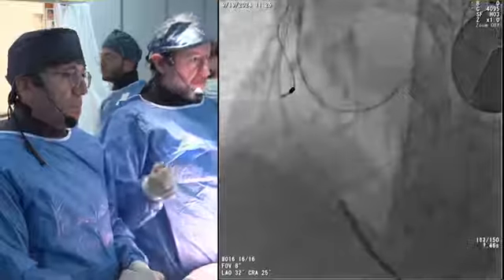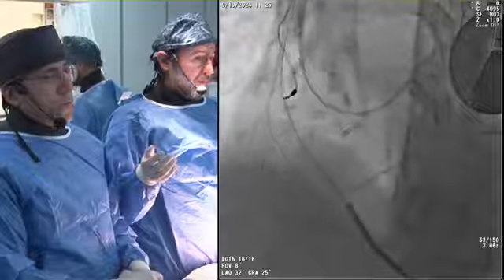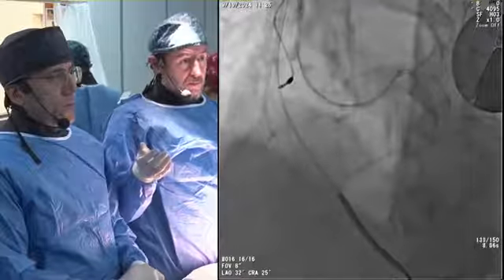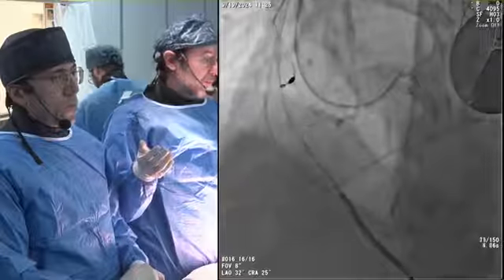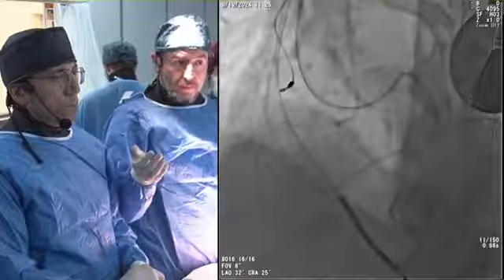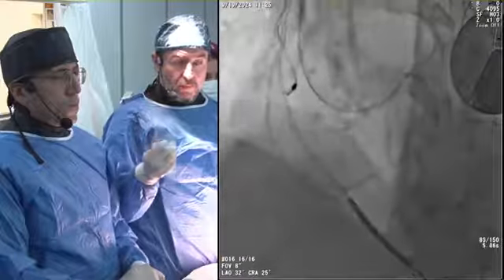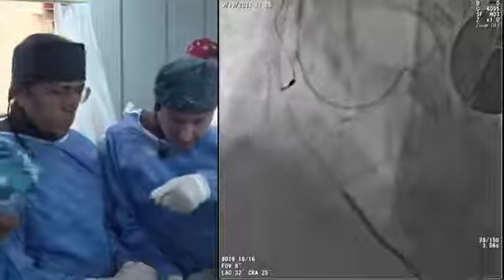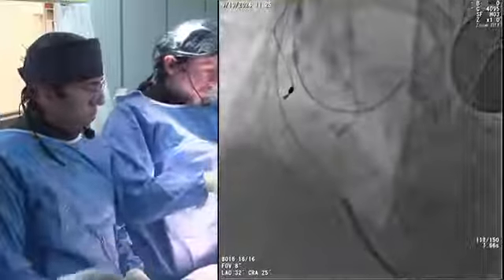Yep. Sure, please. So the problem here, we have an unstable antegrade guide, we have an ambiguous proximal cap, and we have actually unclear retrograde anatomy. So the problem with experience is, when you push stiff wires trying to get to the ostium, the RCA in that position is actually curving about 120 degrees. We never appreciate that by angiography because we're only looking in two views. So the most dangerous thing now is to use pokey wires and to actually follow them with a microcatheter because you're going to exit the vessel. And in fact, this wire is outside the vessel.